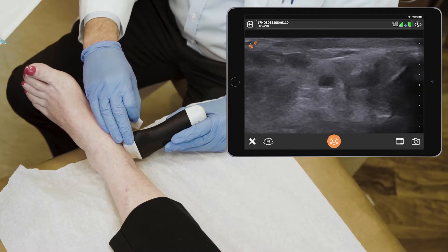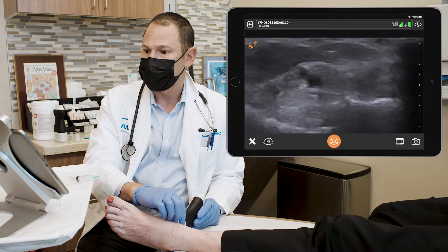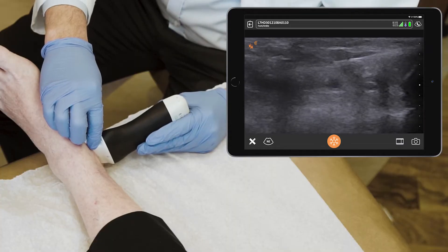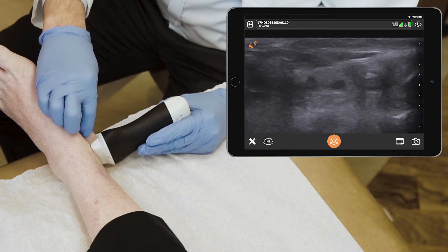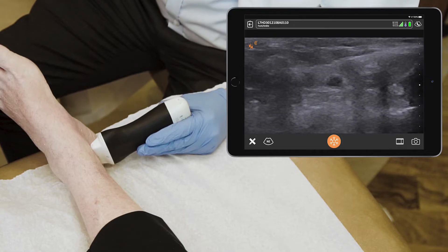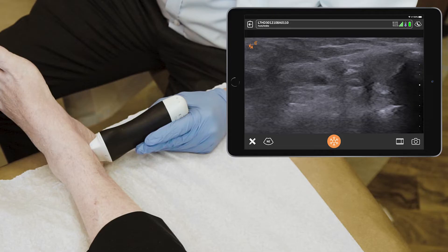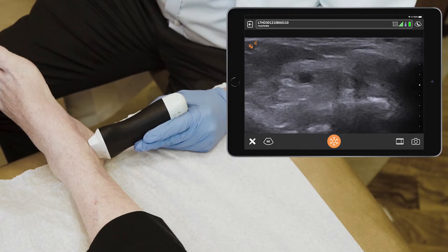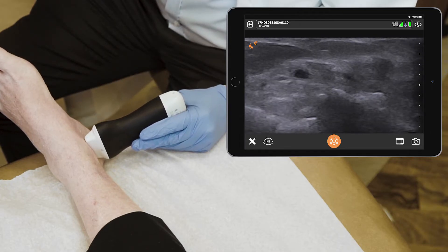I'm going to go a little distal to make room for my needle. To do this shot I'm going to have to hydrodissect a little bit to get enough room for my needle between the bone and the target tissues. And go slightly at an angle.